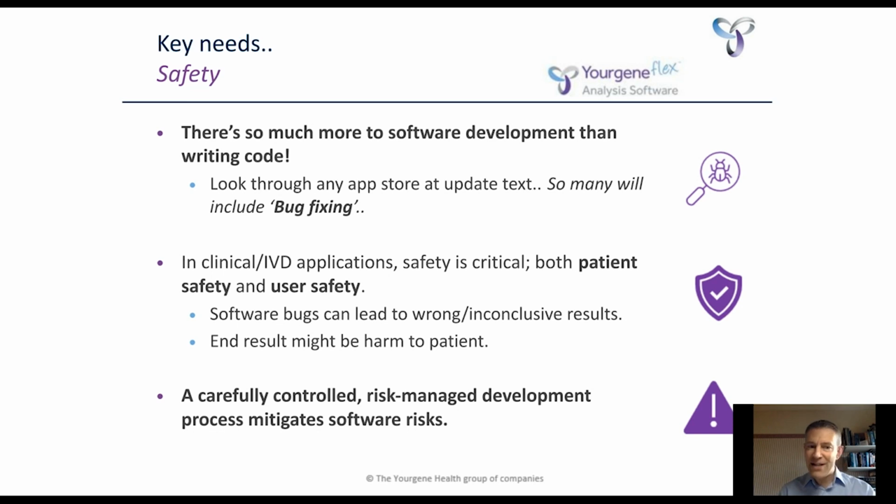In many cases, some of that software may not have been written or tested with medical safety in mind. You go out of your way to try and find solutions that are, but ultimately code that's written by someone else under a process that you don't know is inherently risky unless you thoroughly validate it. So the path that we have to go down if we're not writing all the code ourselves is to make sure that all of those relevant functions are fully risk assessed and fully validated before we go any further with them.